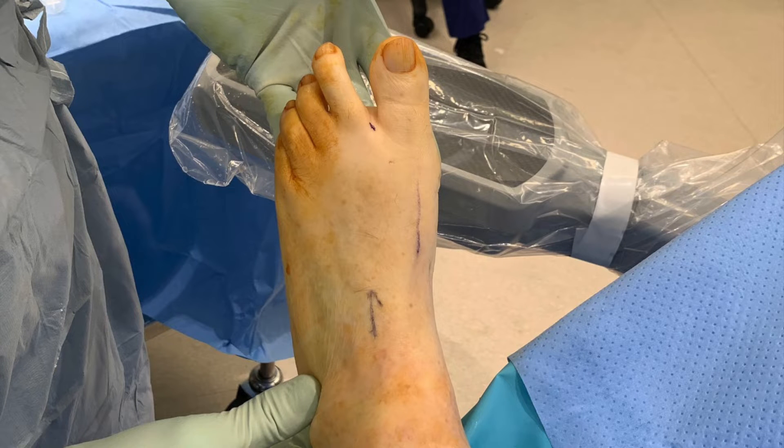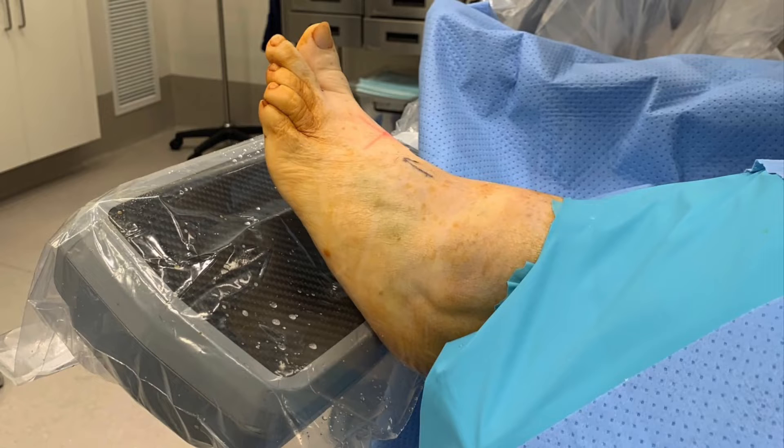The patient is positioned supine with the ankle hanging off the end of the bed, which enables the foot to rest on the receiver of the image intensifier. The use of a tourniquet is a personal preference and may not be required if performing isolated proximal phalanx osteotomies of the lesser toes.